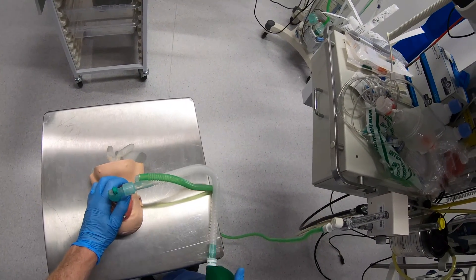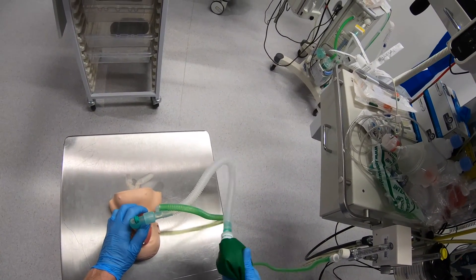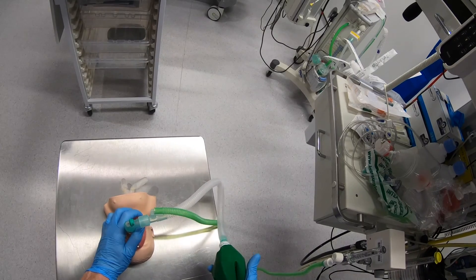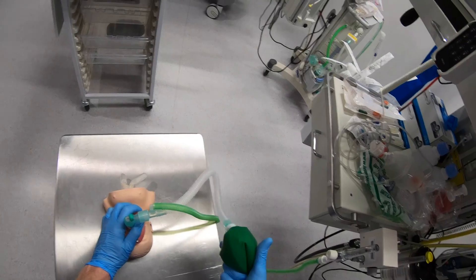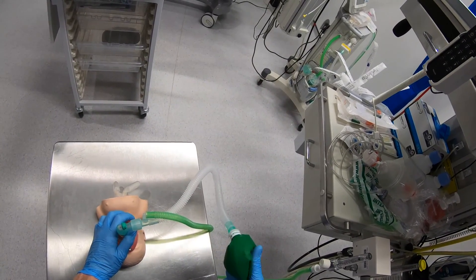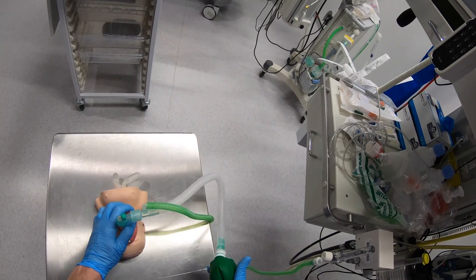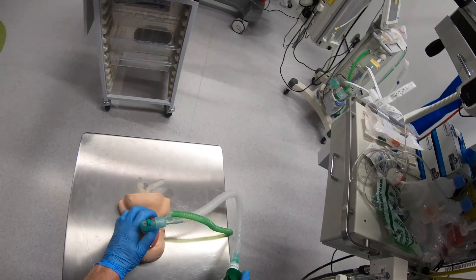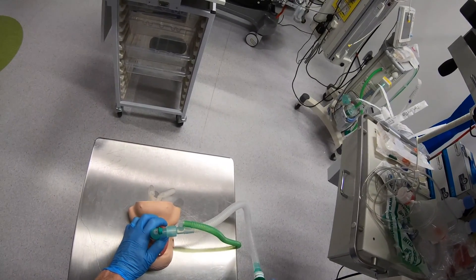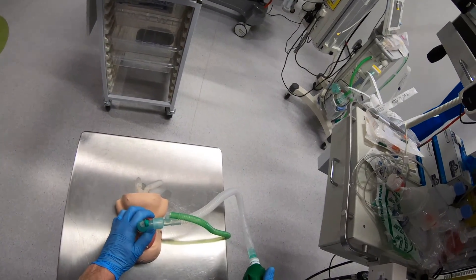If I have the bag all the way up and squeeze it I'm giving much bigger tidal volumes — actually excessive tidal volumes for a patient of this size. So I can either just squeeze the bag a little bit, or I can hold it slightly further up and have a smaller effective bag and squeeze it more. All the time I'm looking at my patient, checking for chest lift, and gauging how hard I squeeze the bag based on that.